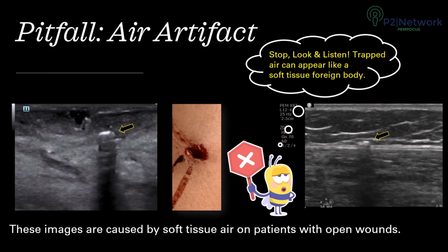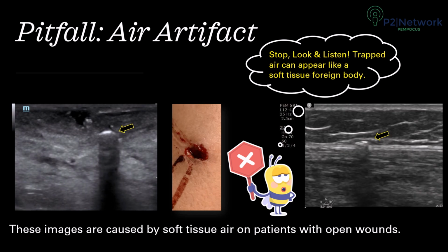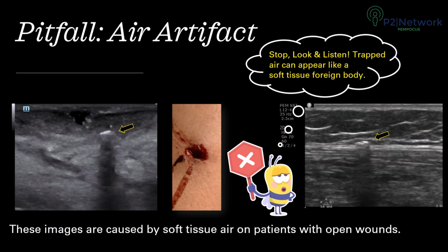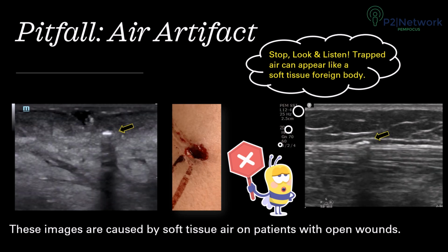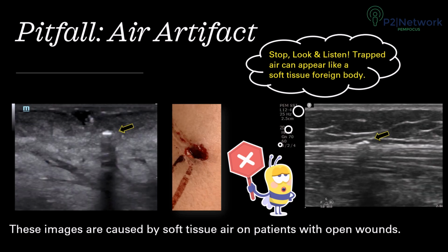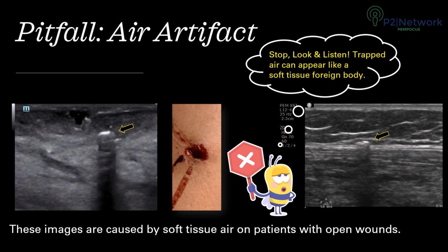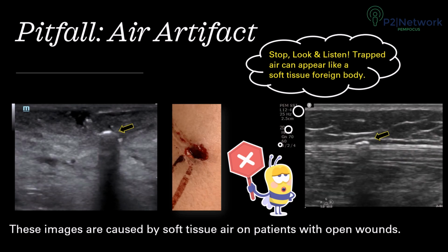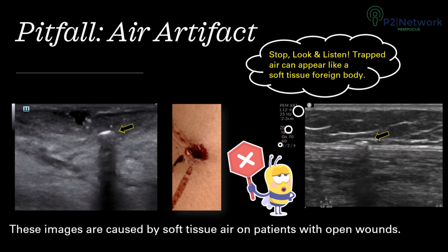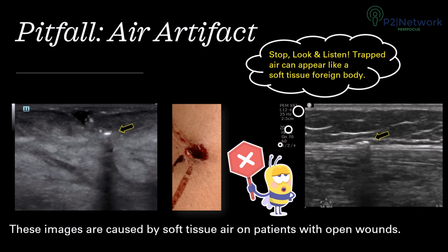Stop, look, and listen. Both these patients had open wounds. Trapped air can appear like a soft tissue foreign body and even create a shadow artifact. Try to gently compress, irrigate, or inject local anesthetic to see if this artifact disappears.